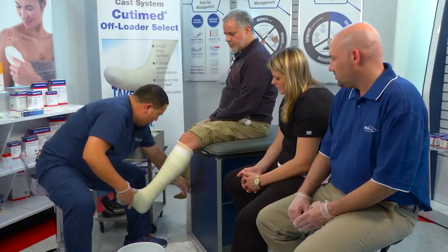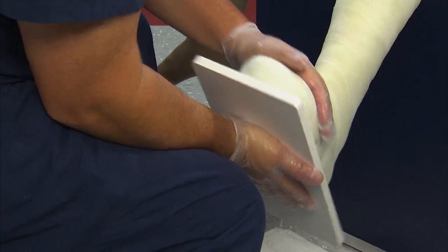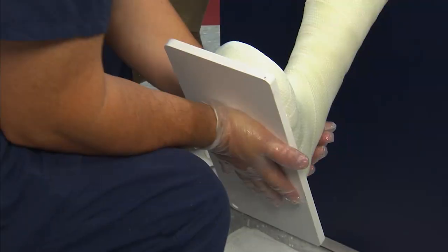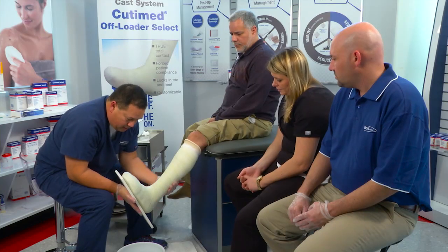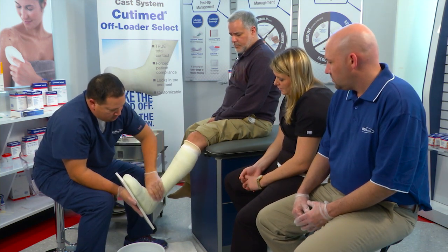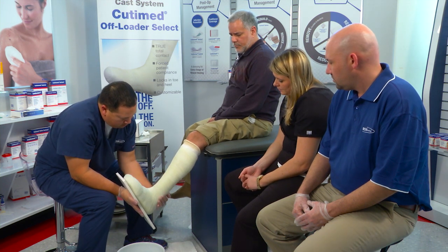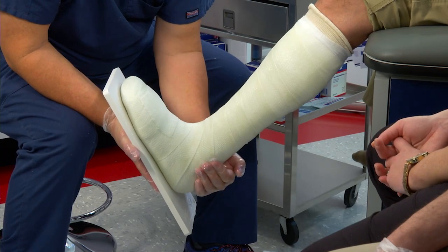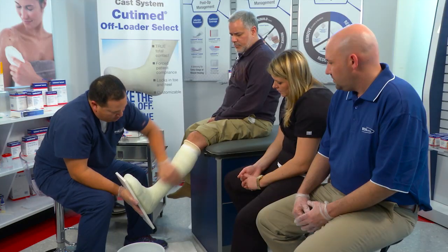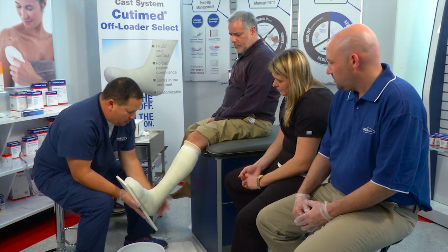Now I grab my board, place it underneath, and give some pressure here. The lamination process has started. The key to the mold is behind the malleolus to the gastroc insertion, because what we're doing is offloading into this cone of the cast. If I keep them at 90 degrees and laminate this cast, giving that nice tension behind the Achilles to the gastroc insertion — laminate all the way around, trying to avoid pressure directly on the malleolus, just behind it.